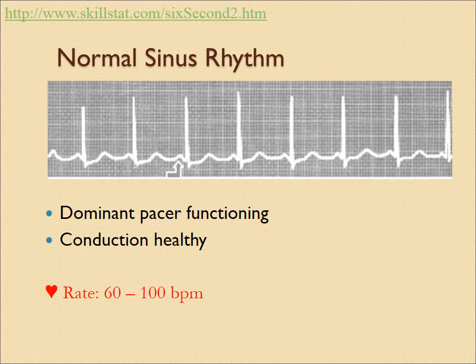Normal sinus rhythm. You'll see at the very top of this page that I have a website listed there that you can utilize. It actually gives you practice on different types of rhythms. It does encompass all the rhythms, so that will be a little annoying to you because when you get an atrial fib, or an atrial flutter, you won't know it. But it will help you with other ones. And of course, the web has a lot of different sites that you can use to help you practice on this. So normal sinus rhythm.